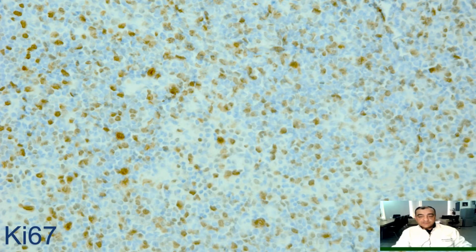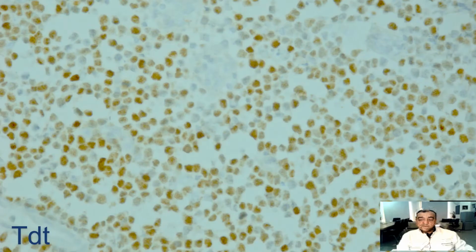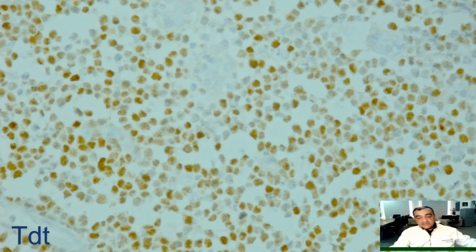Of course, high Ki67 labeling shows that we deal with an aggressive tumor, and it's typical for acute lymphoblastic leukemia cells. The next immunostain which must be included is the marker which shows the blastic origin of the tumor cells.